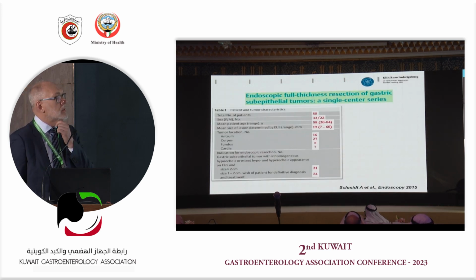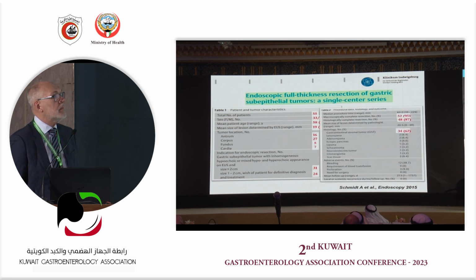So these are our results. 55 patients located all over the stomach. The size was larger than 2 centimeters in 31 patients.